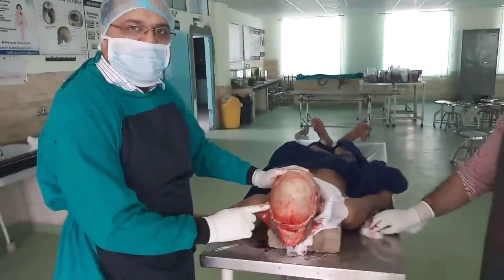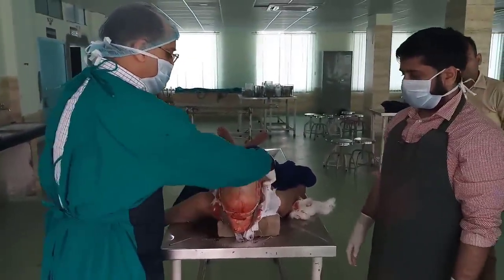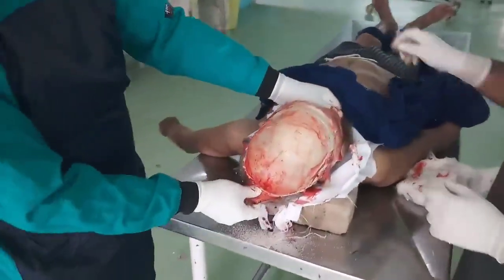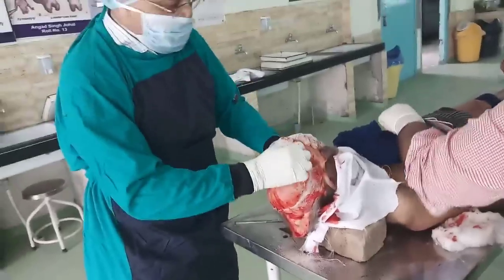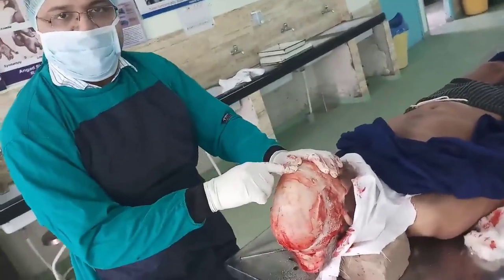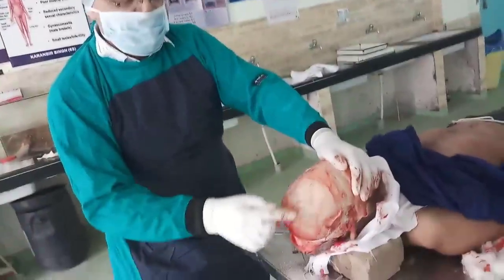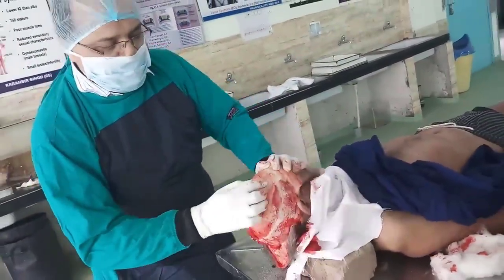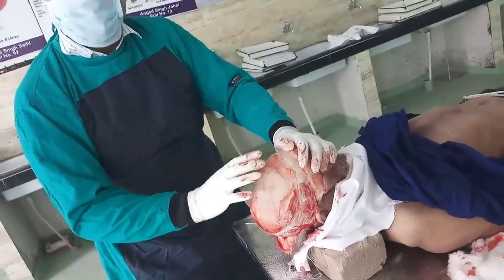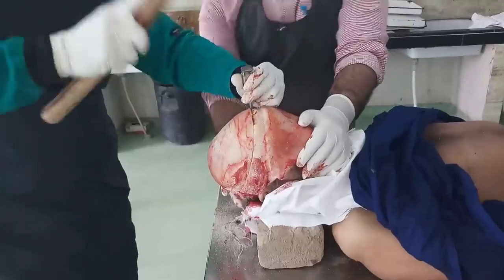Now our step was to open the skull cap. First we had retracted the anterior flap forward and the posterior flap backward. Then we had made an outline anteriorly above the supraorbital margin, posteriorly around the occipital protuberance. Then between the anterior and posterior cut, an angle is made. So we had made an outline to open the skull cap. Now we will use our chisel and hammer.